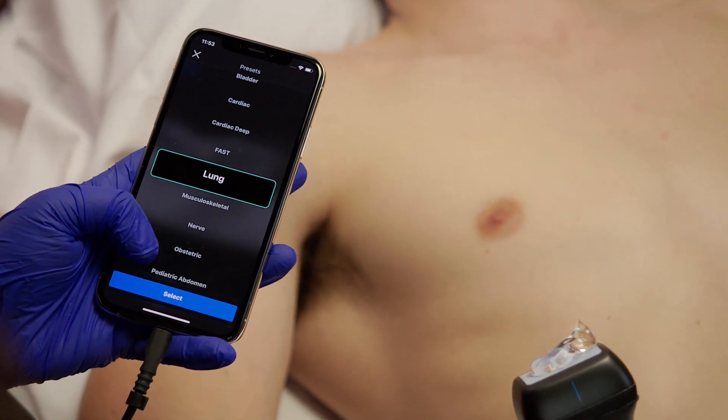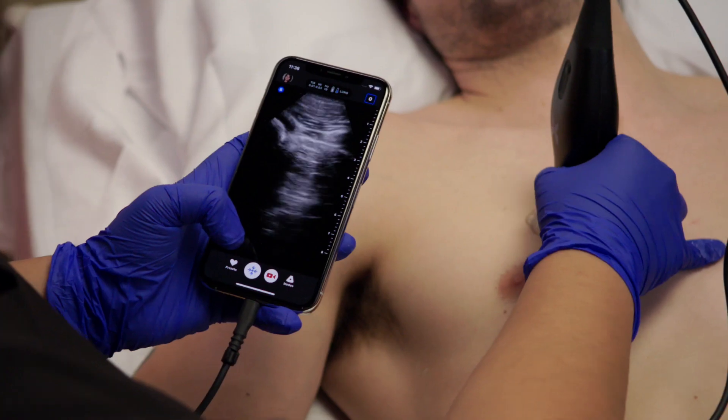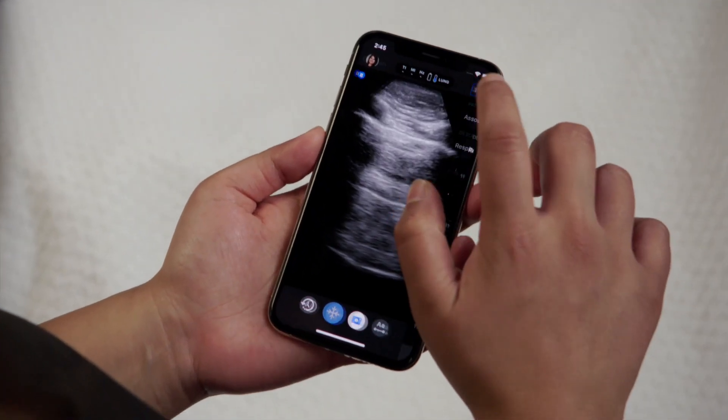Now all you need to do is change your preset, scan, capture, upload. It's that simple.